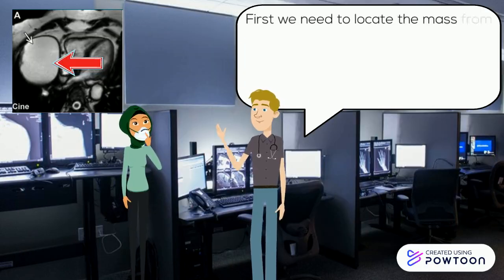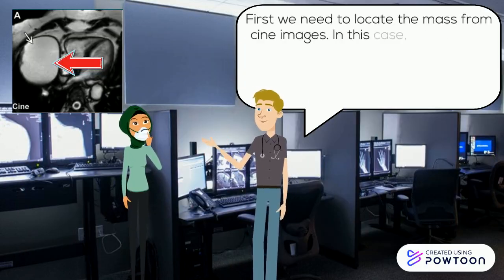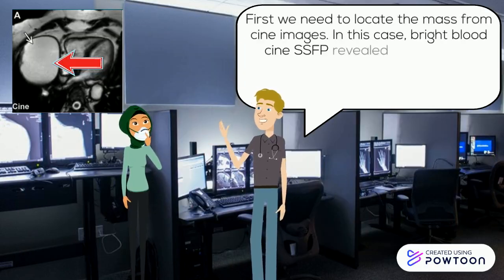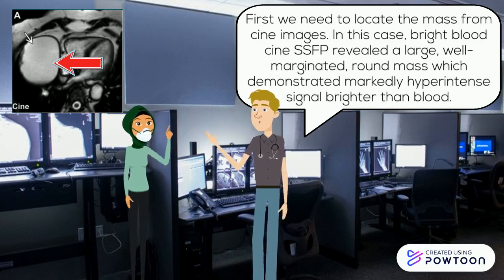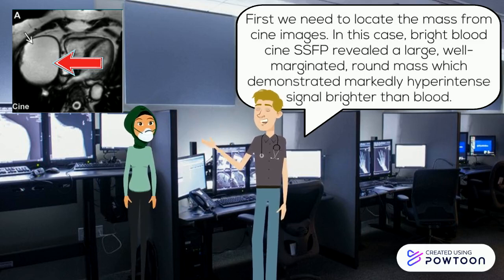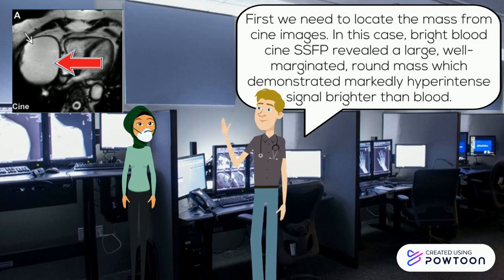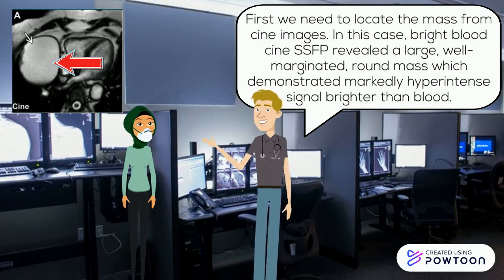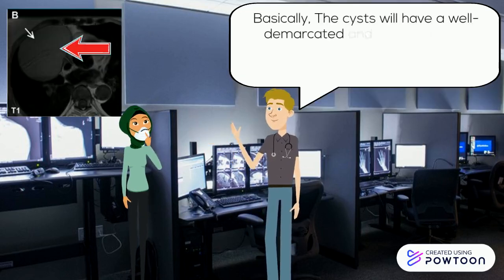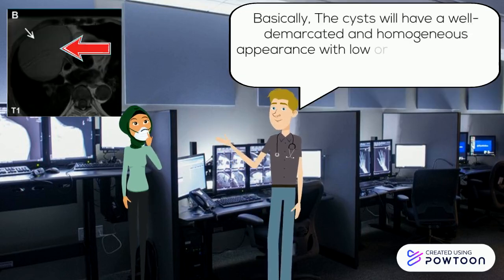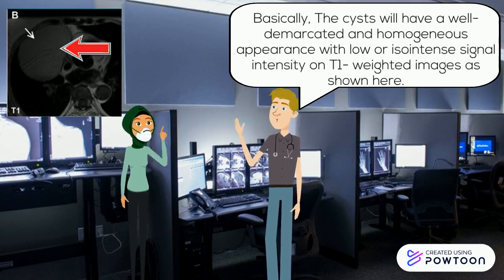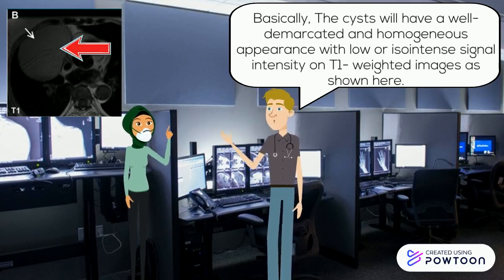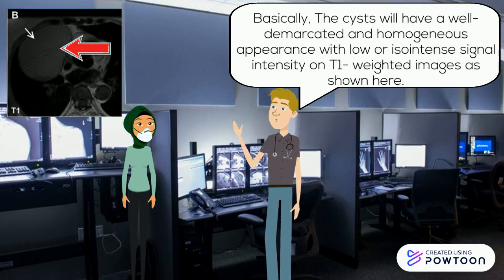First, we need to locate the mass from cine images. In this case, bright blood cine SSFP revealed a large, well-marginated, round mass which demonstrated markedly hyper-intense signal brighter than blood. Basically, cysts will have a well-demarcated and homogeneous appearance with low or iso-intense signal intensity on T1-weighted images, as shown here.